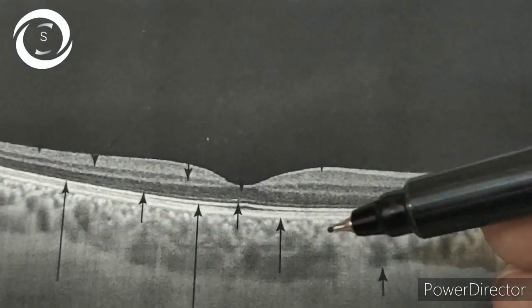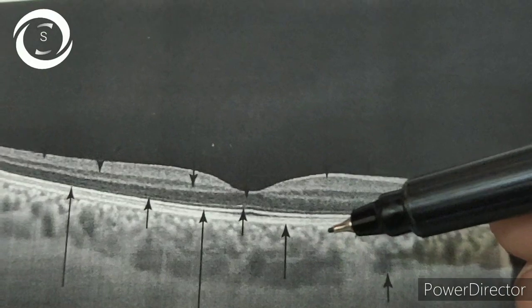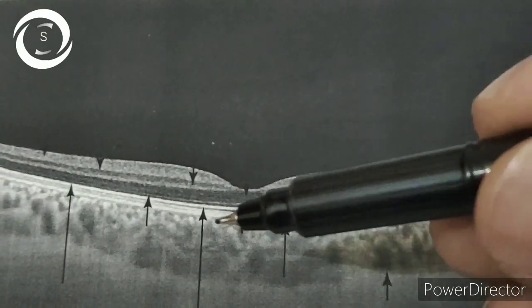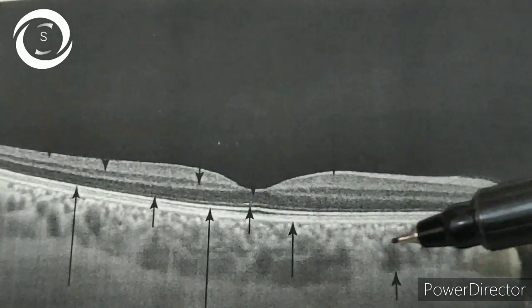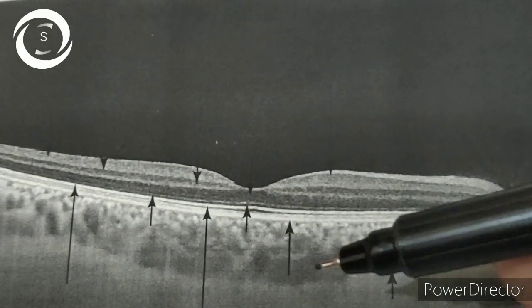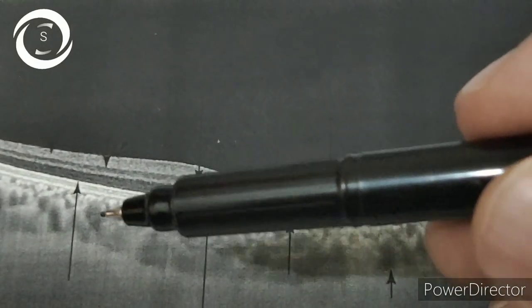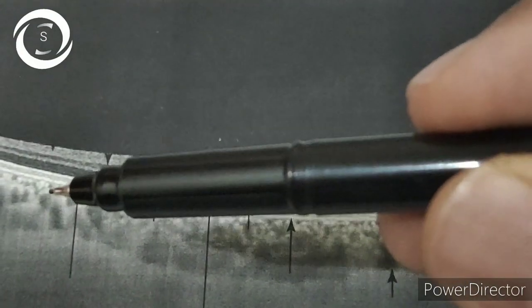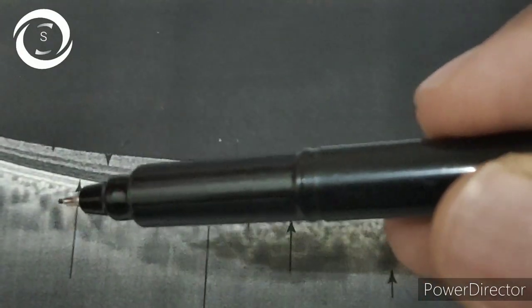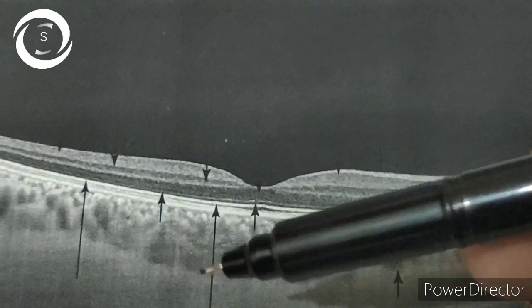Beneath the RPE Bruch's membrane is the choriocapillaris, and you can easily appreciate the lumens of the large choroidal vessels here. These are the choroidal vessels. You can see the round lumens of the choroidal vessels.